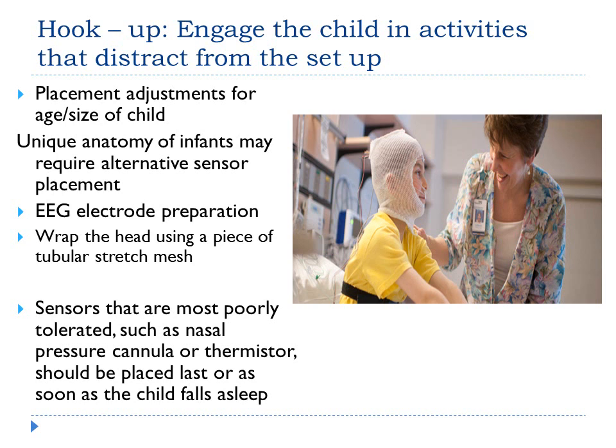preparation. Once you do get your electrodes on, you might want to wrap the head in a piece of tubular stretch mesh, as you see in the picture here. Wrapping should not be excessive, as that creates some undesirable effects, such as sweating and electrode popping, and then you're just creating more work for yourself. But this mesh material does allow better air circulation, and it keeps their head cooler, and you can see how they kind of made this one into just a little bit of a mask, so it just fits over their head nicely. You can also see they ponytail the electrodes, which most of us do with our adult patients anyway, but that does help prevent getting tangles and whatnot.